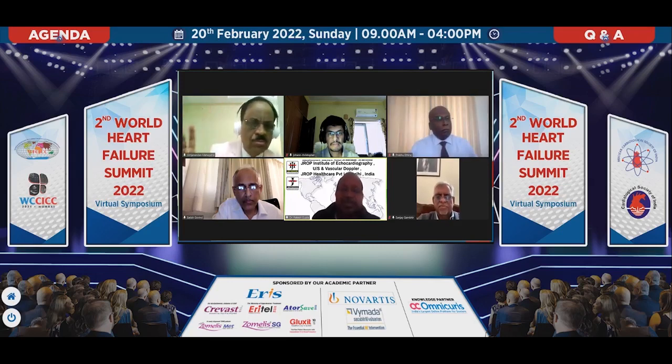Third important thing is LA strain. I said very categorically, if you have a patient with dyspnea on exertion where no coronary arteries are involved, second important thing is you find LA which is dilated, and these people do not have any resting diastolic heart failure. Either you do an LA strain or you do a passive leg raising test to unearth the evidence of diastolic heart failure. So we are doing LA strain, especially in those populations where we are expecting diastolic heart failure, but with reports, with the present guidelines, we are not able to establish the diastolic heart failure. Thank you, Dr.